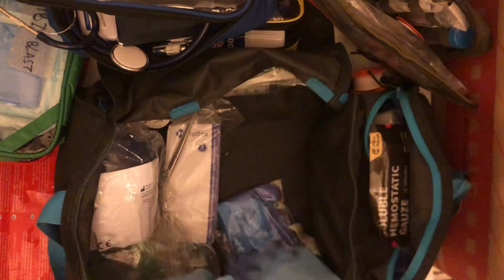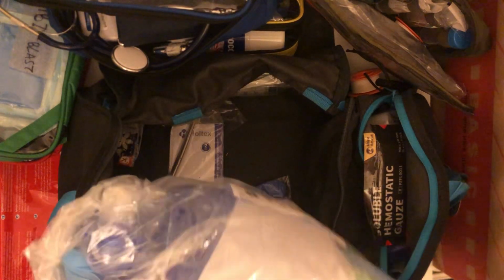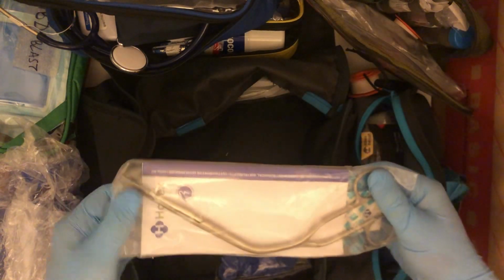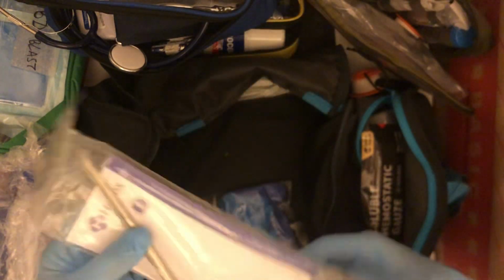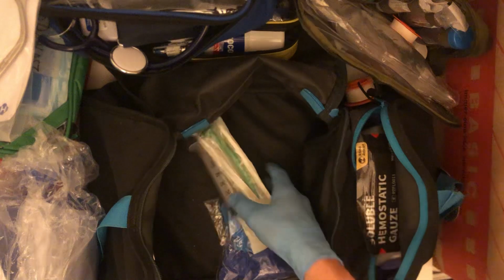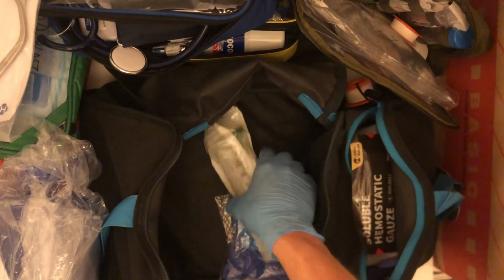Then at the bottom of the bag I got everything airway related. The first thing every paramedic and EMT should carry is a bag valve mask. This one is still in the wrapper, adult sized. Then I got Magill forceps. These are an ALS skill, advanced life support, and I'm going to be using them to look for foreign bodies in someone's airway that could be obstructing it. I use it with a laryngoscope, but for now the laryngoscope is in the car kit.